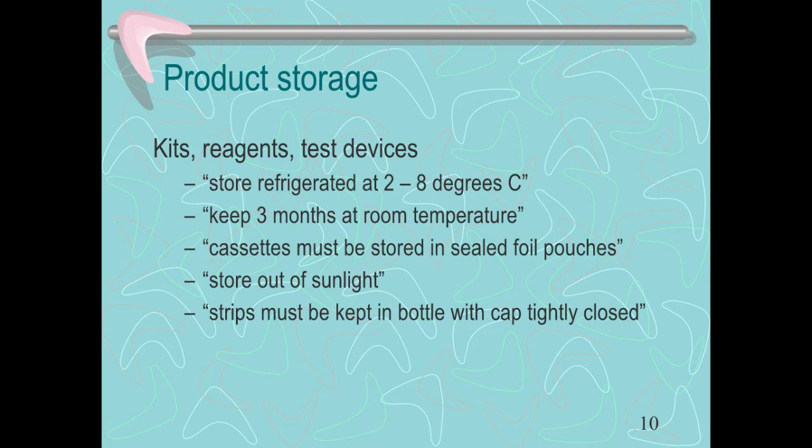They can be anything from hemoglobin A1C to certain types of reagents to urine dipsticks. So be sure that you're familiar with how to look for what product storage is needed.